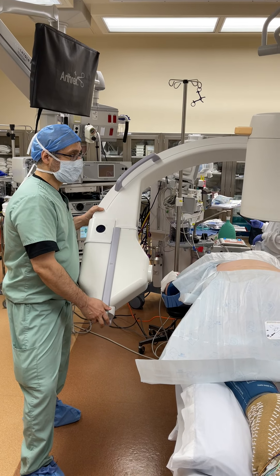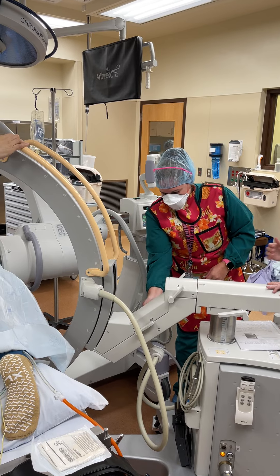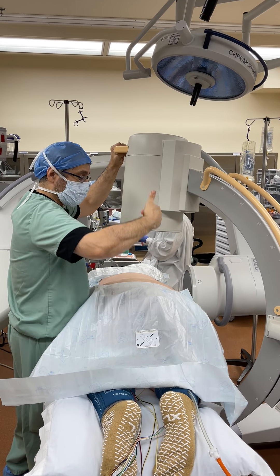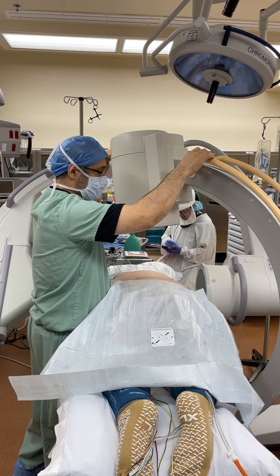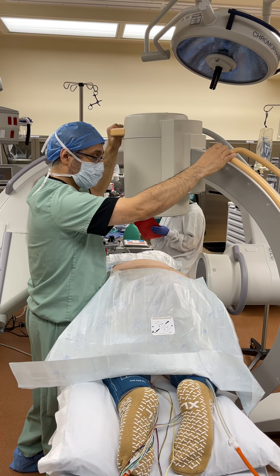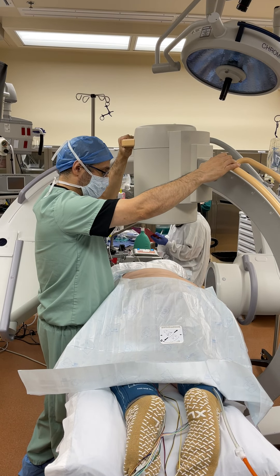Lock it. With the AP, if you open the front two — now those are the back two, sorry — open the front two. With the front two, I can adjust for rotation. You need to lock the base please, go up to the machine. Now I can adjust for this axis and this axis. I always do this myself because this micro adjustment is very hard for them to do from the back. Lock the front two. Open the back two — going up and down, right and left by opening the back two.